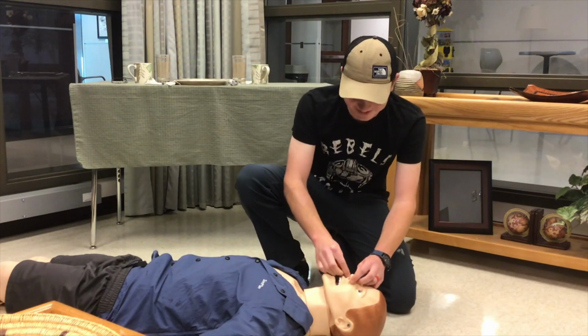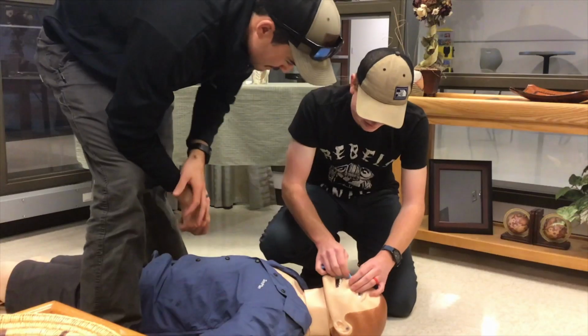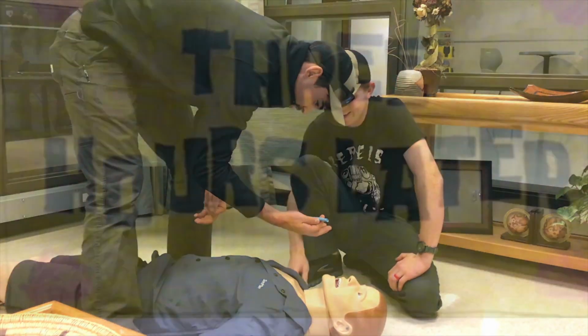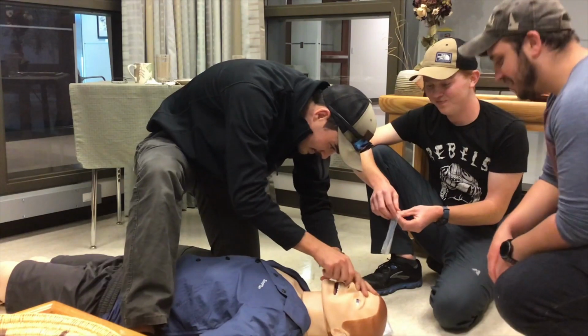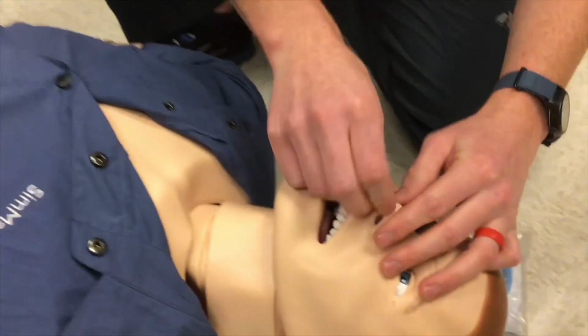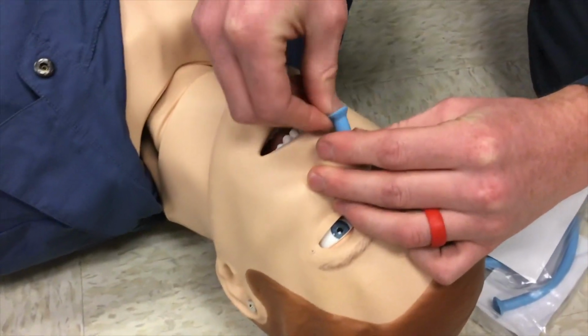That's not going in very well. What size is this? Did you use the 28 on him the first time? Yes, and it went in easy. There you go. You can take a picture of it. No, right there, right there.